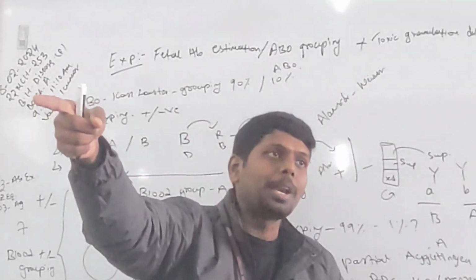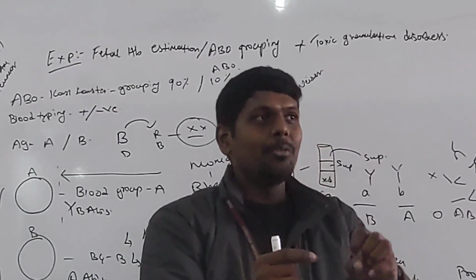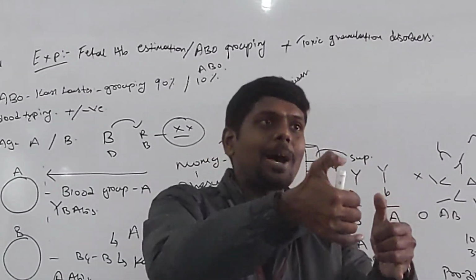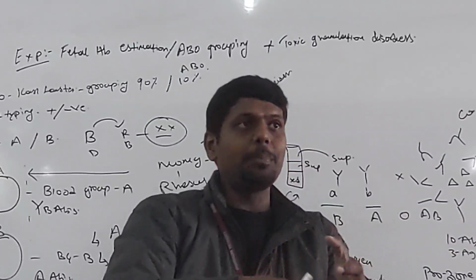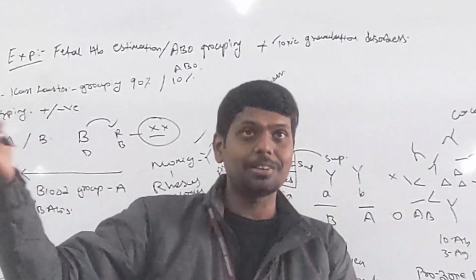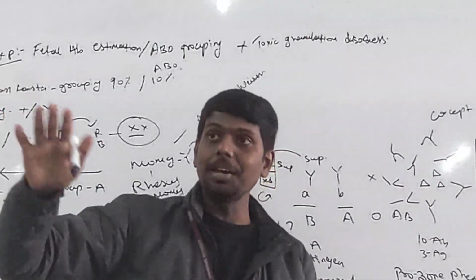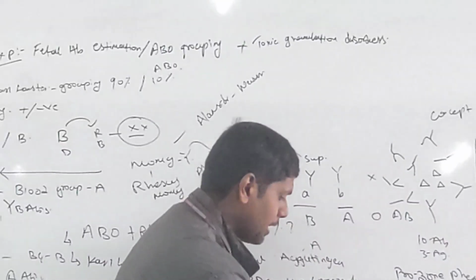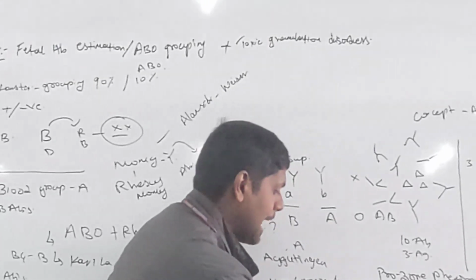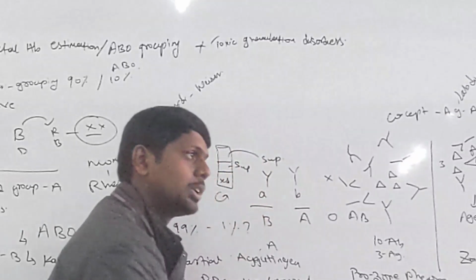Our loan said one important thing. Inadequate mixing. We added 1 drop blood and 1 drop anti-sera, but I didn't mix it properly. Maybe in hurry. Usually in blood bank this happens. We need to issue packet very fast because someone is dying in the surgical room. So that time that might happen. So inadequate mixing can cause false negative results. Any more?